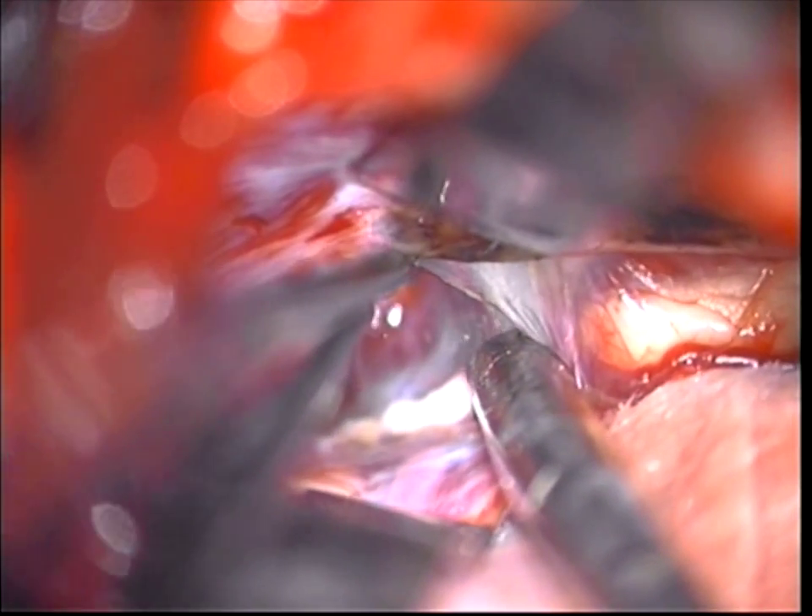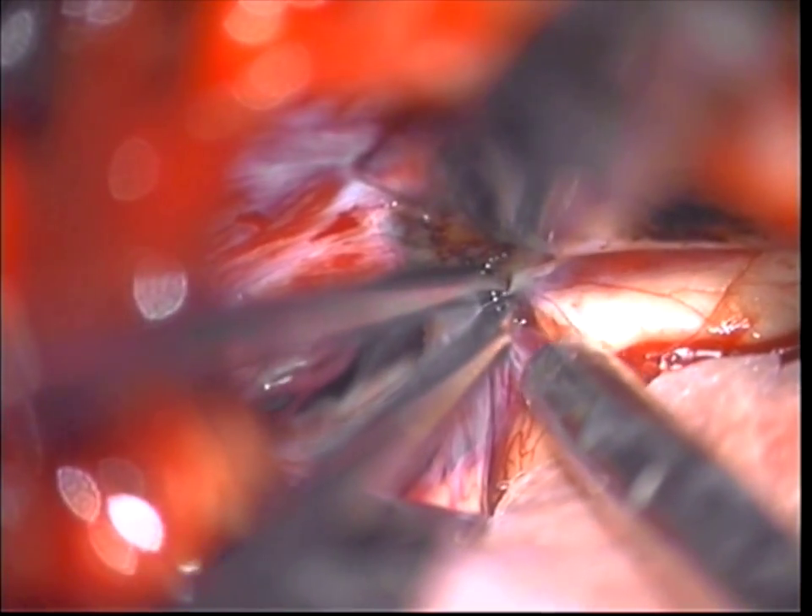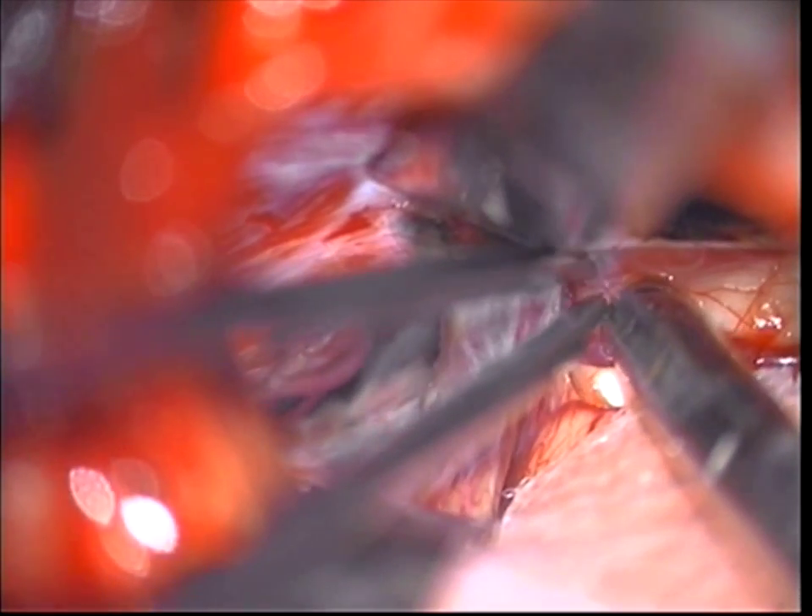Very careful dissection. You notice there's a retractor on the falx as well, so it opens the corridor a little bit better. We use the frameless stereotactic system all through so that our trajectory goes straight down. We're going pretty deep here through the deeper lesion, coming in deeper into the area. Sometimes you'll see the tumor right here — in this case we felt we needed a slightly bigger approach, taking some of the vessels off at the posterior part of the corpus callosum.